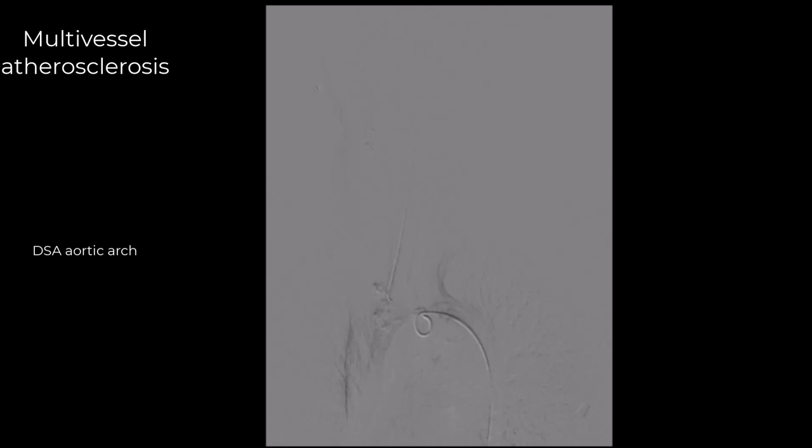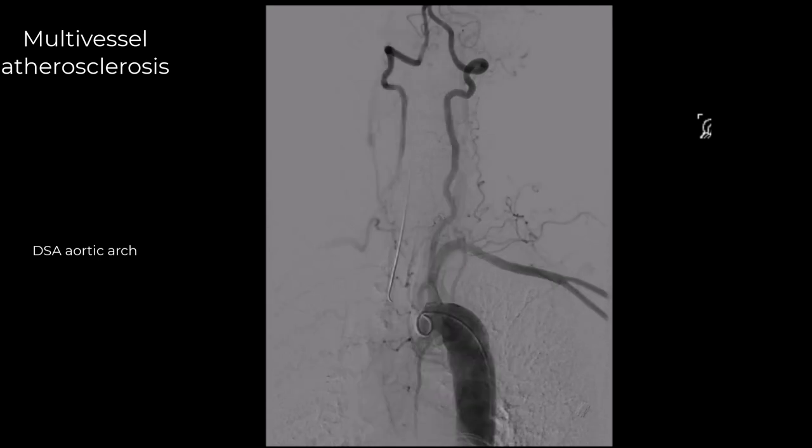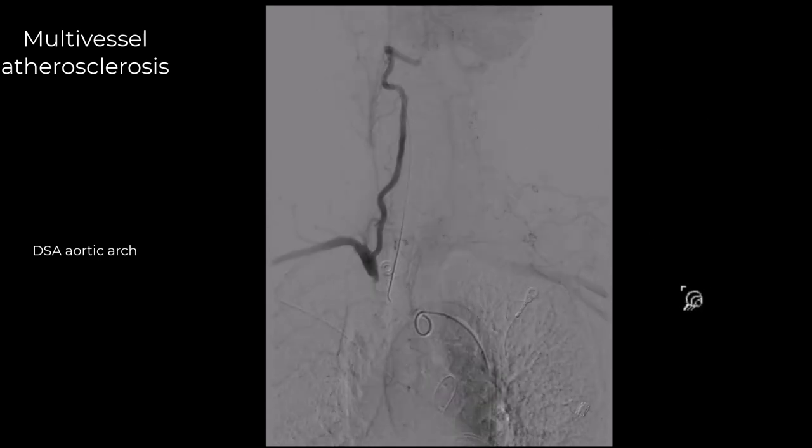That information about the physiology of the vertebral arteries was inferred from the previous CTA, but we do have an injection of the aortic arch that was done the following day, and we can see the opacification of the left vertebral artery, which is filling antegradely. It goes to the basilar artery, and then we see retrograde opacification of the right vertebral artery, and as that progresses, it goes all the way to the right subclavian artery.